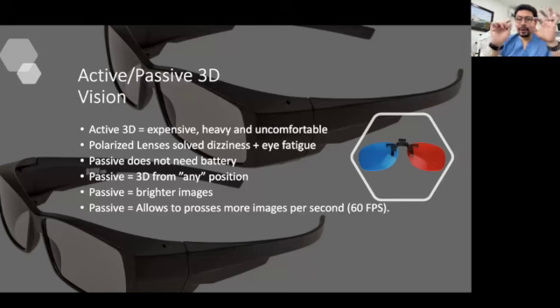And you can go from very specific procedures to more general procedures, I would say, in which you do not need very specific precision of movements. Depending on the procedure, you will choose the magnification.